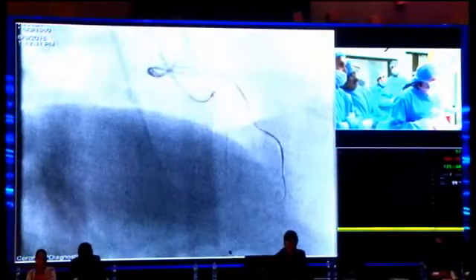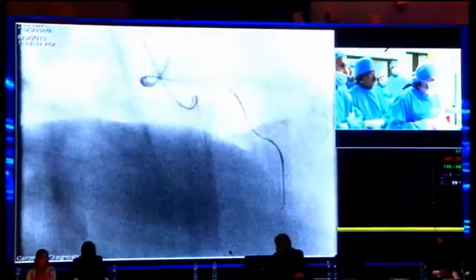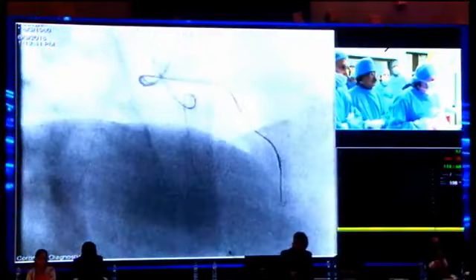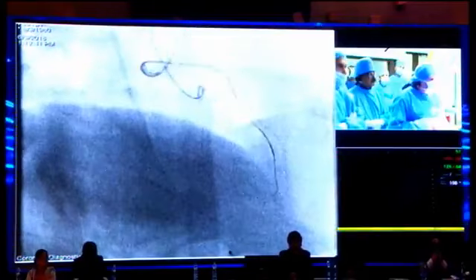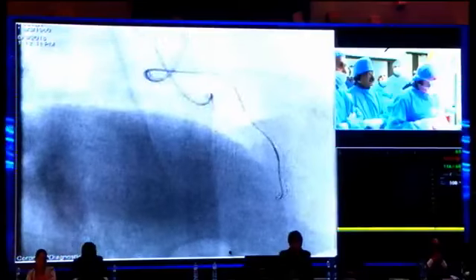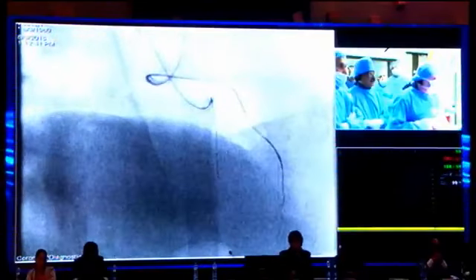Dr. Matsu, do you have any other technique to do this now? What's your plan for this situation? You have two acute angulations, it bends up almost 90 degrees, and a very tortuous septal channel, and this septal channel vessel diameter is very big and very bending.